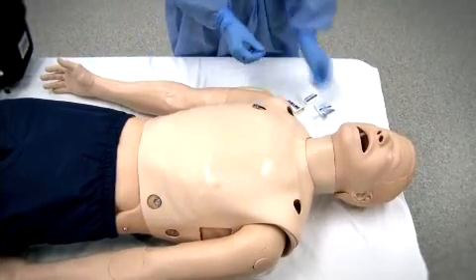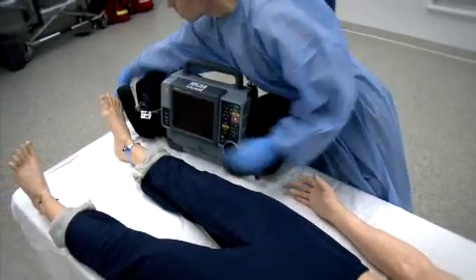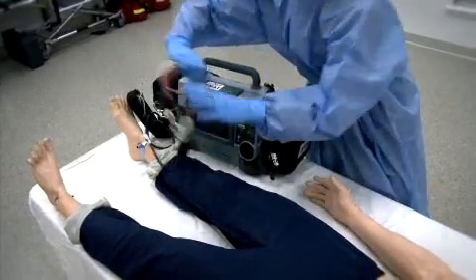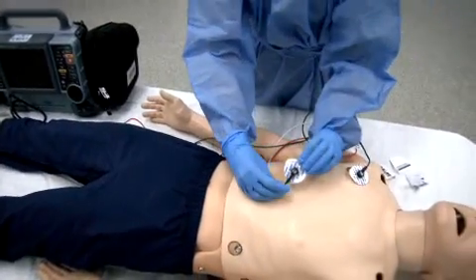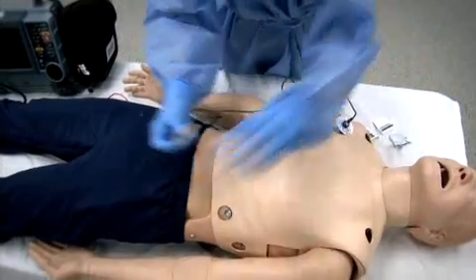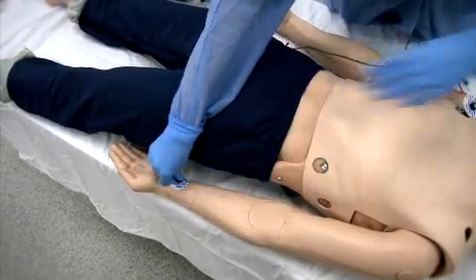In most circumstances, you have already initiated continuous cardiac monitoring, and the 4 limb leads will be in place and the patient will be on your stretcher. If not, apply these leads first and initiate continuous cardiac monitoring. Placement of these electrodes on the limbs improves accuracy of the 12-lead acquisition.